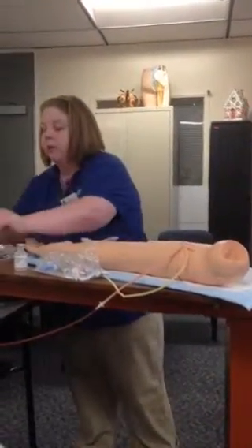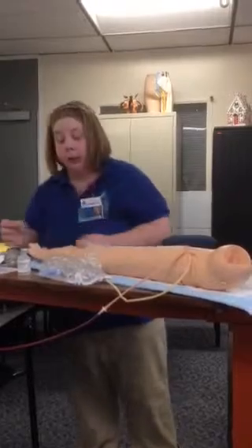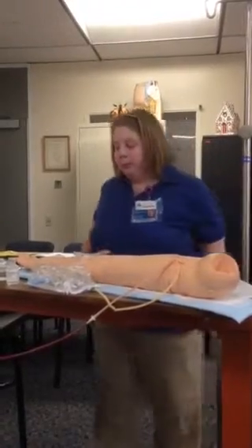My doctor has ordered 500 milligrams of vancomycin to be administered every 6 hours, and I have 500 milligrams per milliliter available, so I will administer 1 ml of vancomycin into my saline.